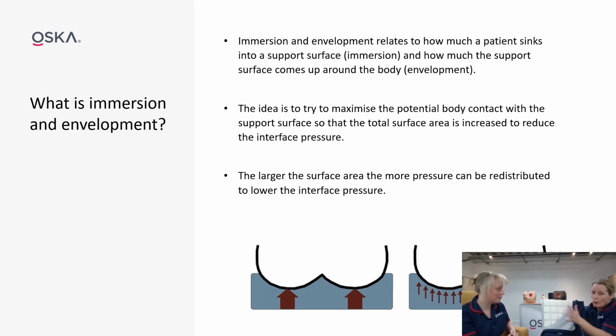So when we talk about immersion and envelopment, it really is about reducing that high pressure, spreading it out much wider over all of the tissue in contact. So when a patient sinks into the foam, that wraps, as Anita said, around them and makes sure that that pressure is much lower, which means that they can tolerate the surfaces for longer.